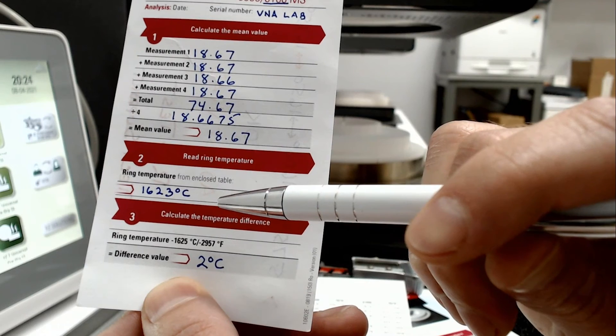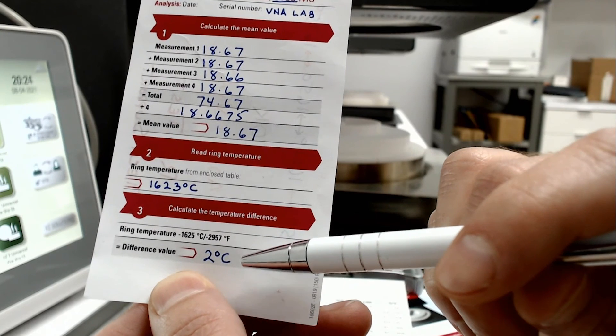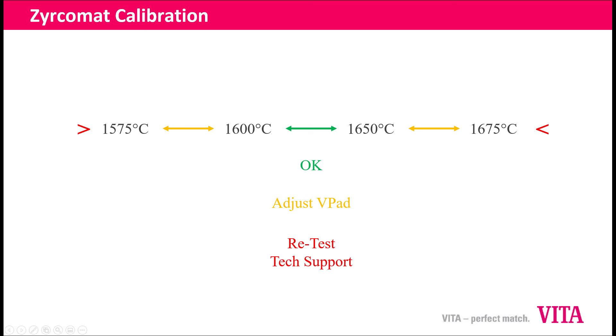We're going to subtract that from the reference value of 1625, which leaves us a difference of two degrees. I've created a cheat sheet to tell you what to do with that value. The value we're comparing it to is 1625, and we have a window of plus or minus 25 degrees. So anything from 1600 to 1650 falls within the window of being okay. If it falls within that range, you don't need to make any adjustments — your temperature is testing within proper values.